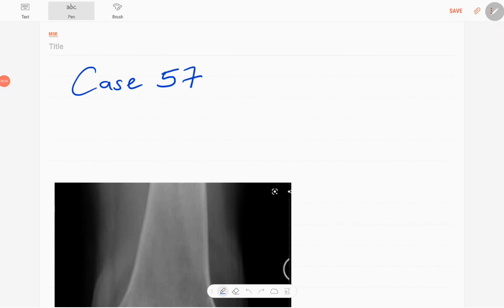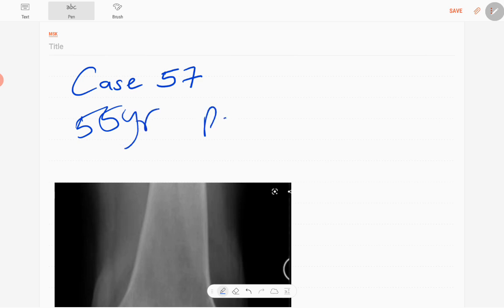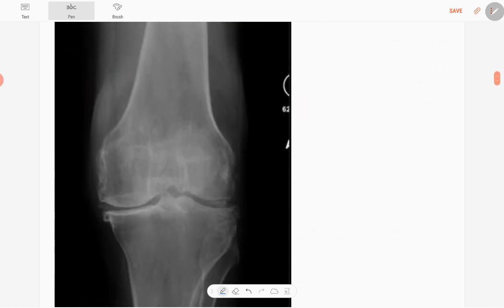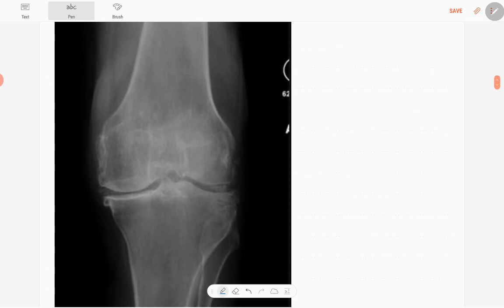Hello everyone, this is case number 57 of MSK series. Today's patient is a 55-year-old patient with pain in the left knee joint. This is the anteroposterior radiograph of the left knee joint in a skeletal mature patient.